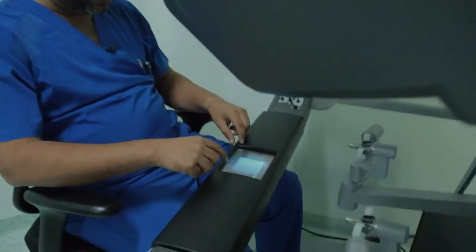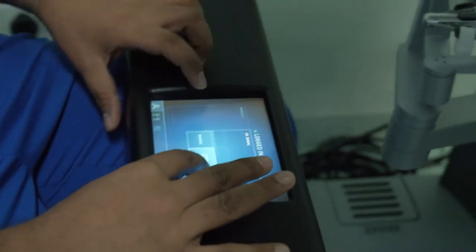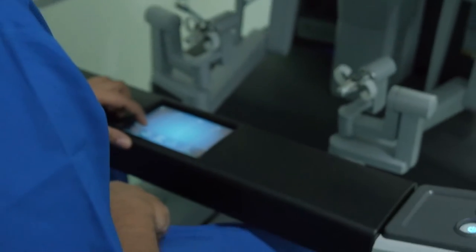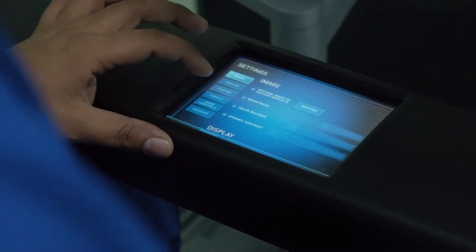This is the touchpad here. So the touchpad actually has various names. You can select the name and you can restore your settings as per your previous memory. Then you will see there are various controls. So these are the audio controls. We also have various settings.